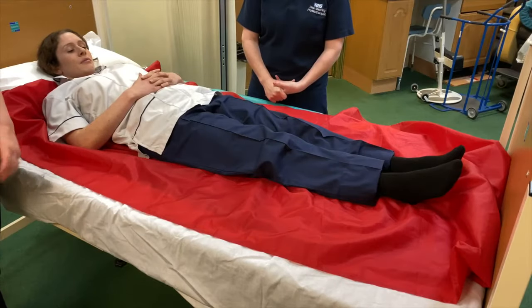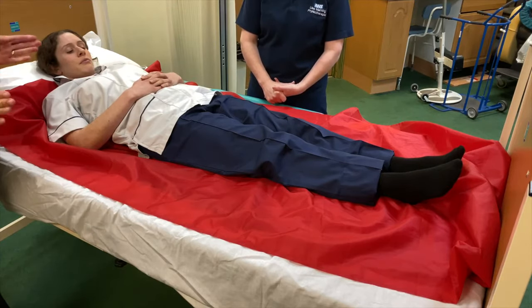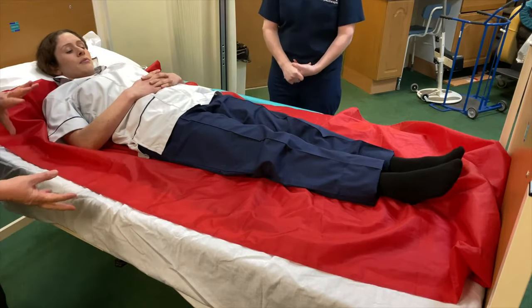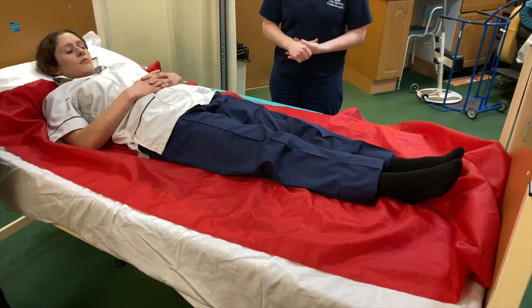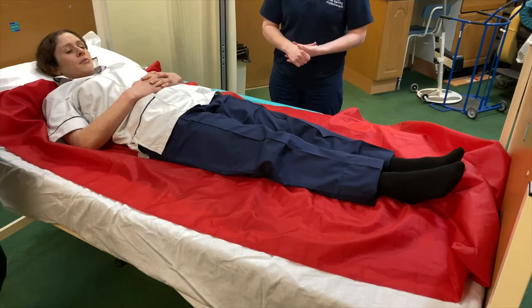Right, we've done supine slide up the bed. Alice is in a nice position now, so if we need to put the bed into profile, she's in a nice position. She is also in the position indicated by her turning chart. She's in a nice supine, lying flat on her back. So we now need to take out the slide sheet in what we call the inverted method.